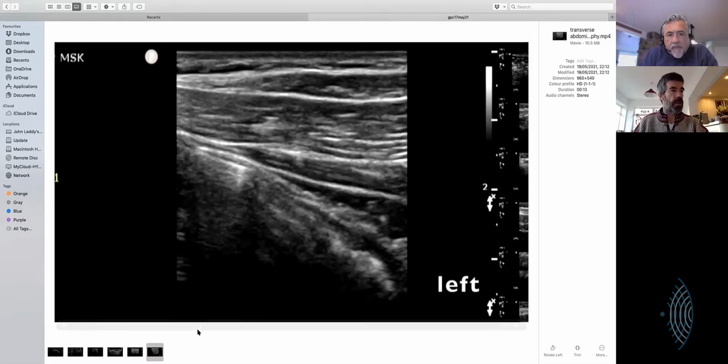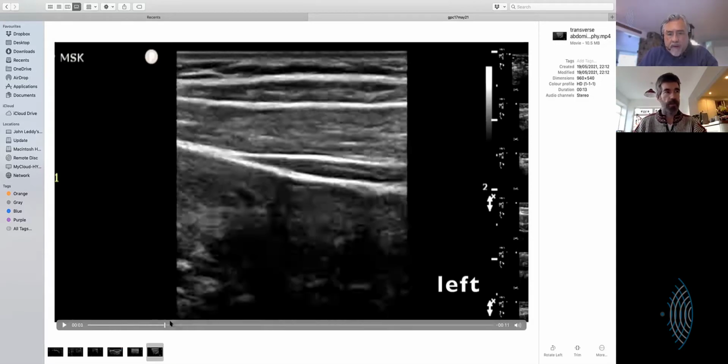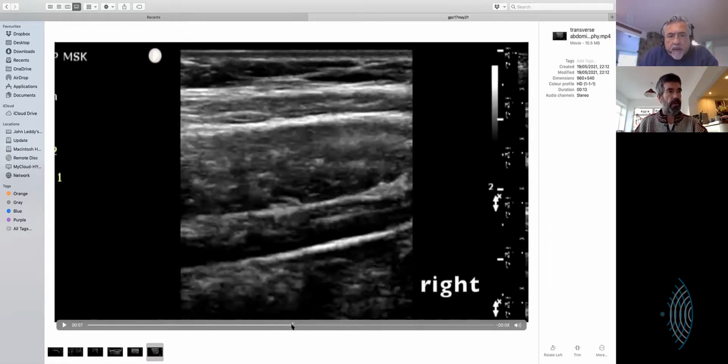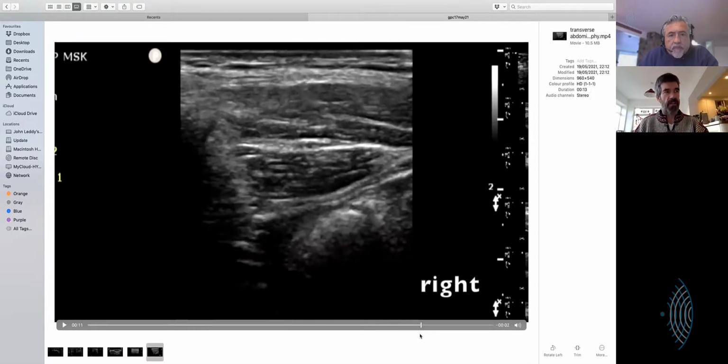Okay. So you've got that different shape to it there. And then you go to that bit where it's the thoracolumbar. Show me the other side again. Here we go. So you lose it, and then you get the crest bit.